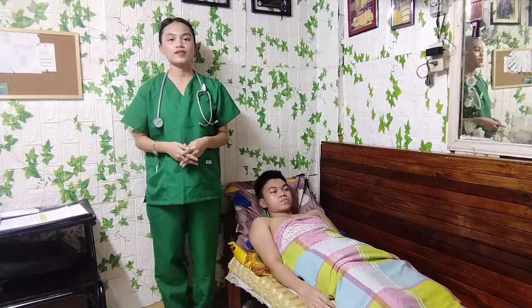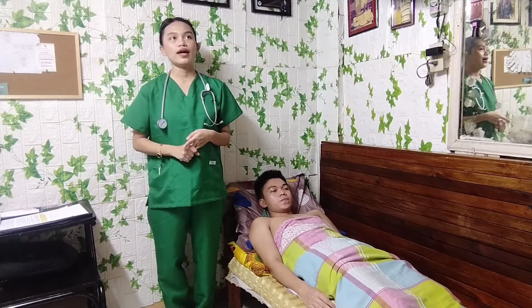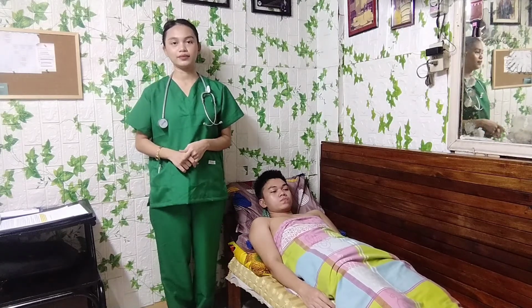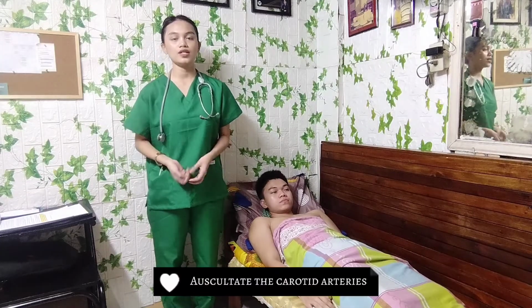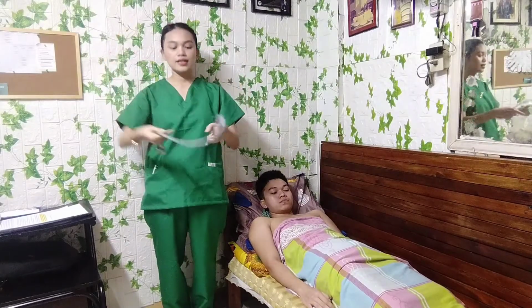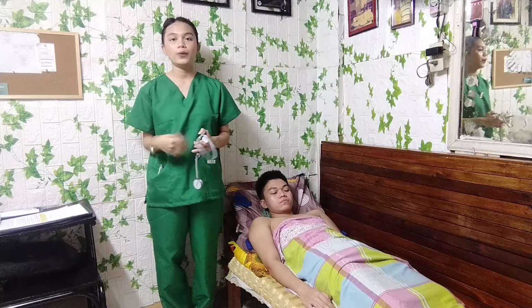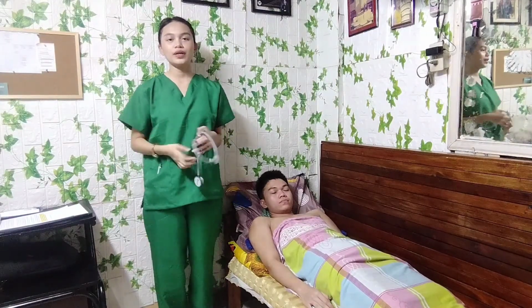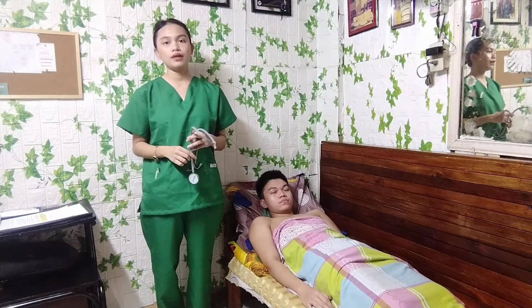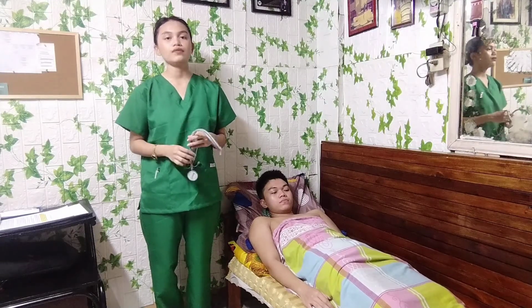The bilateral pulses are equal. They are also equal in terms of rate, rhythm, and strength. And also they are elastic and have a thrusting quality, which is a normal finding. So let's proceed to the auscultation of the carotid arteries using this stethoscope. Okay, for this, I will take note of any signs or presence of a bruit. A bruit is a blowing or swishing sound that may be caused by turbulent blood flow through a narrowed vessel, which is indicative of occlusive arterial disease.